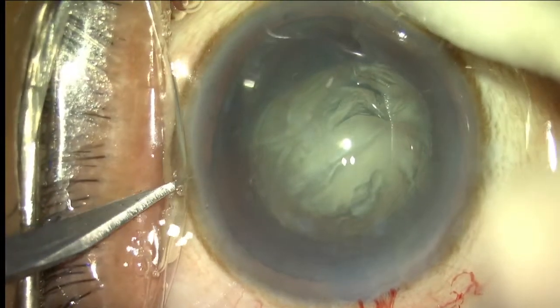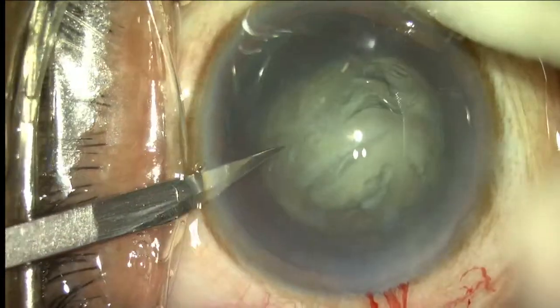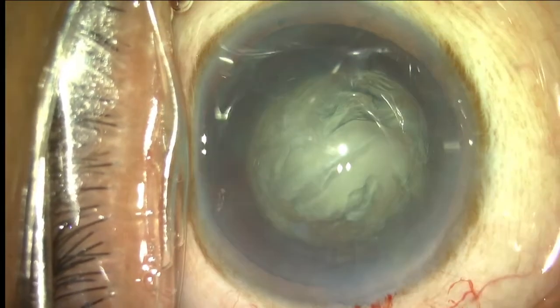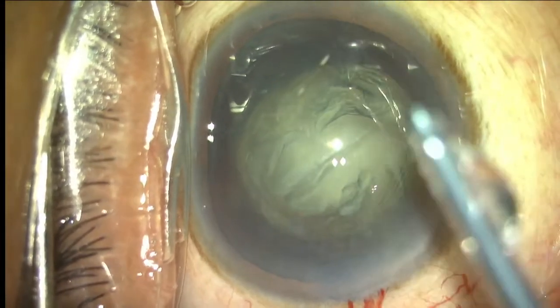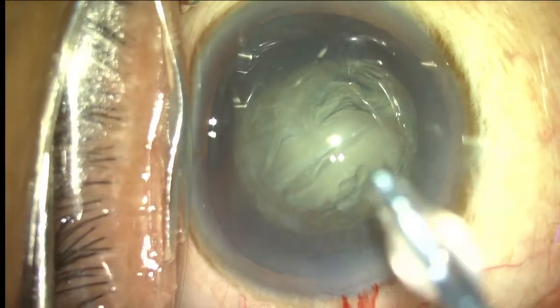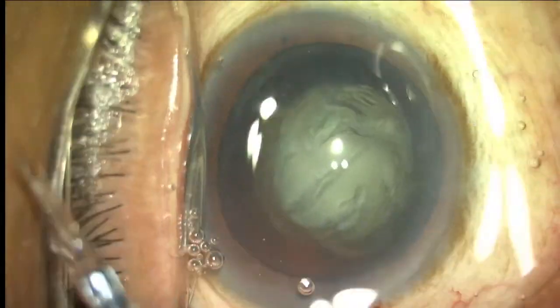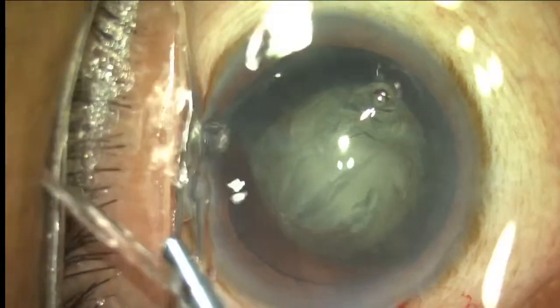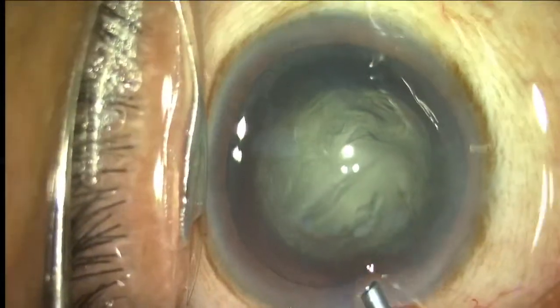I will be making my side port. So I use a direct chop method for nucleus disassembly. The tip has to be exposed a little bit more here. I'm using the straight tip. The gauge of the tip is 21 gauge.